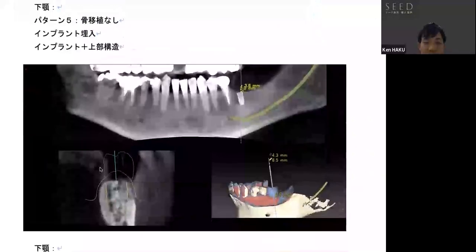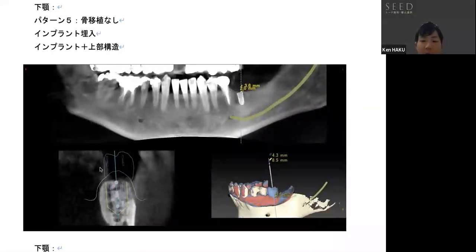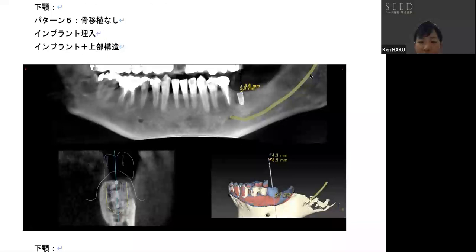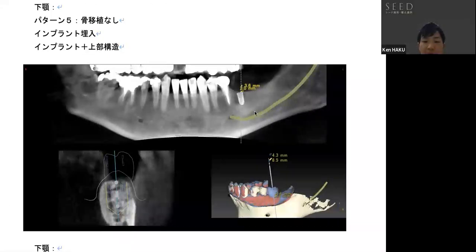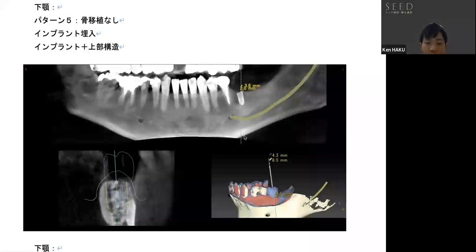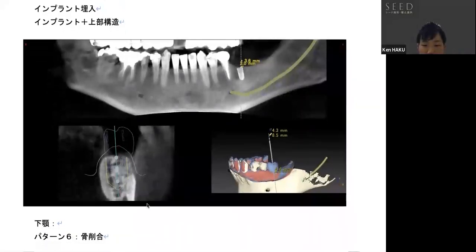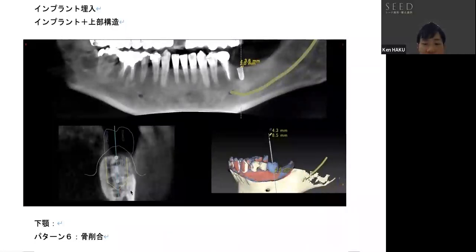Pattern number five is a case without bone grafting. This is a mandibular case. The mandible has a large nerve in the lower jaw called the inferior alveolar nerve, which runs along this green line. If there is enough distance to this nerve, even a long implant can be safely placed. This case is planned with an 8.5 mm long implant, but a 10 mm length is also possible. This figure shows a cross-sectional view of the bone in the area where the implant would be placed. Since there is sufficient jaw bone width, this is a case where the implant is simply placed without GBR.